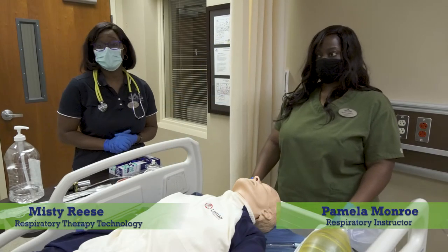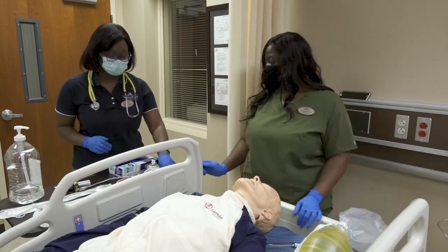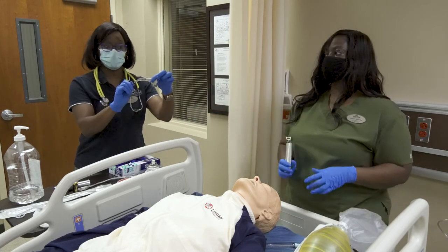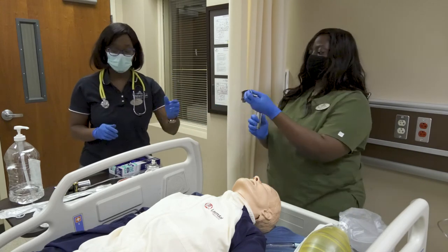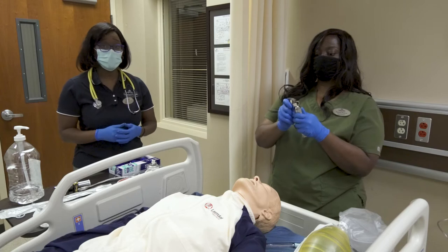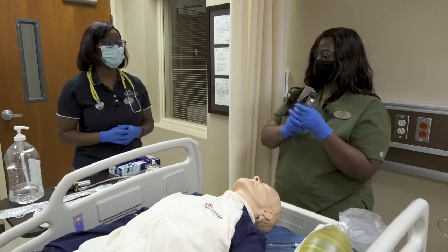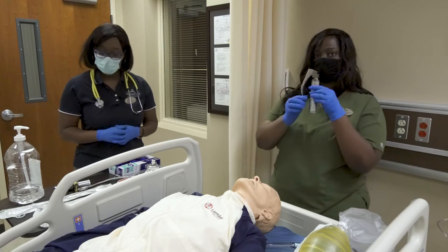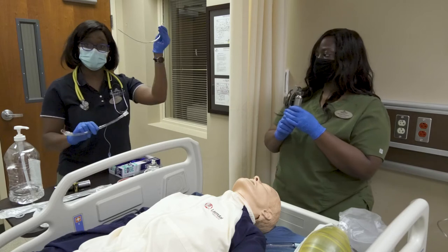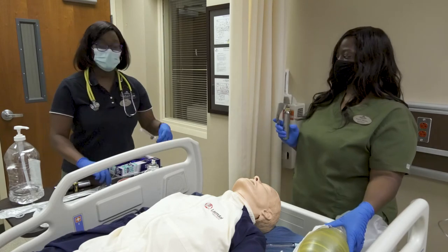Oral tracheal intubation with a Macintosh blade. The Macintosh is a curved blade. The first thing you want to do is gather all your equipment. You will gather your Macintosh blade along with your handle, and also you will need your endotracheal tube with the stylet.